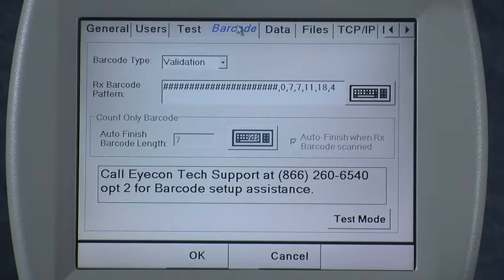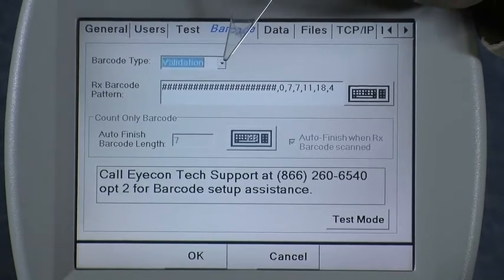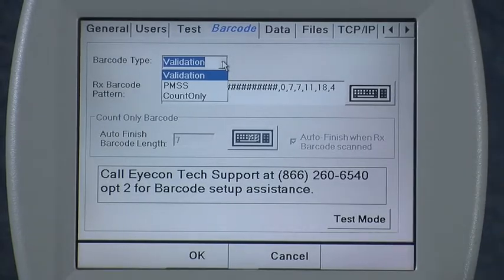The first selection on the menu is the barcode type. On that drop down menu there are three choices: Validation, PMSS, and count only.